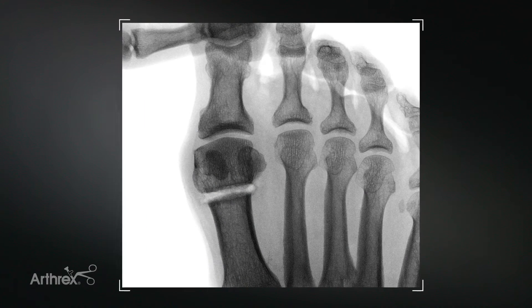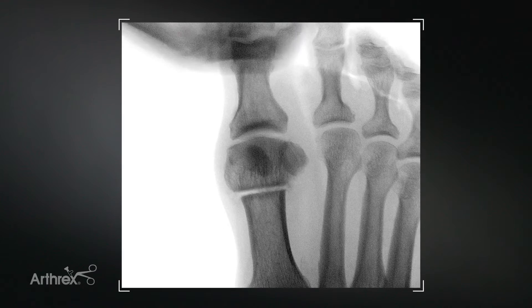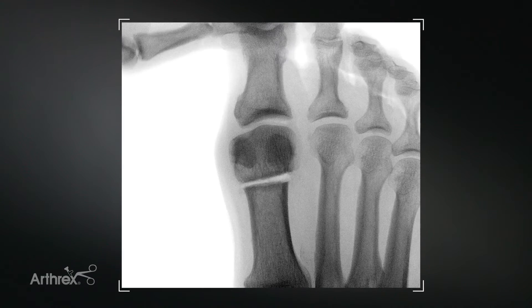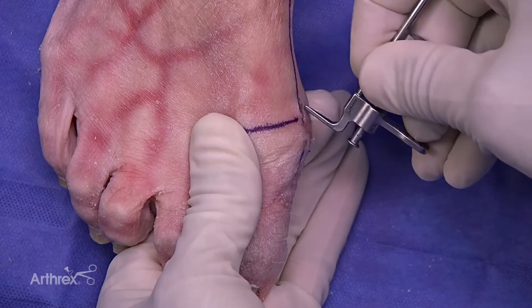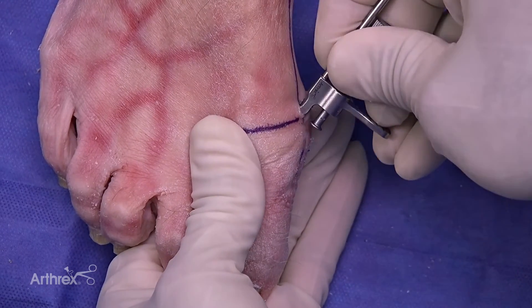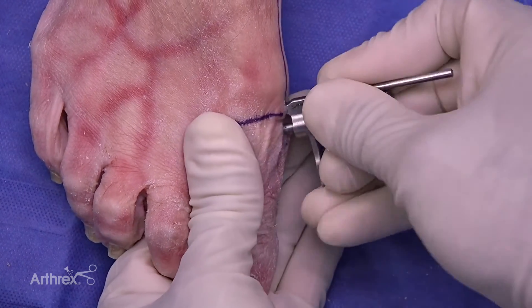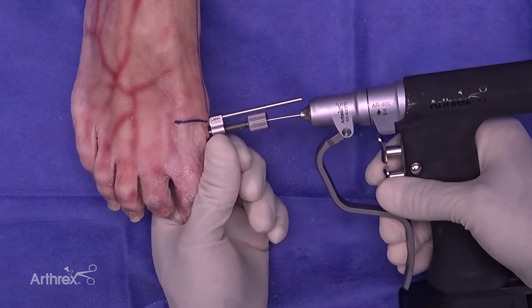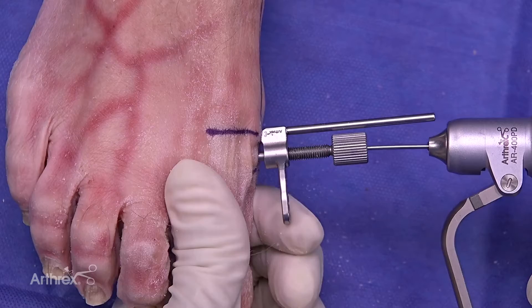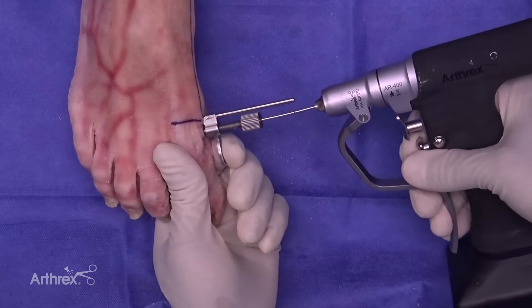We've completed our transverse osteotomy, which is my preference. The transverse cut also allows for full rotation and deformity correction and placement of the sesamoids accurately as demonstrated here. After we've completed the osteotomy, we insert the hook into the medullary canal and we slide the translational device. The cannulated wire is placed through the translational device.